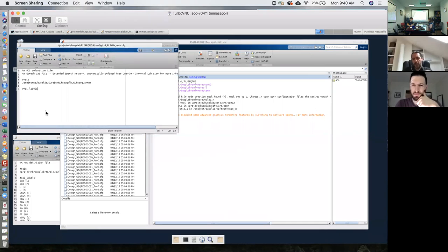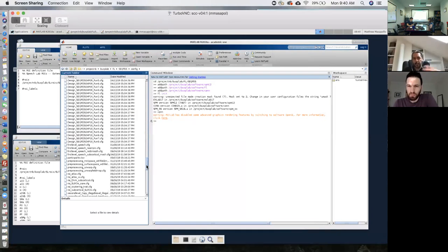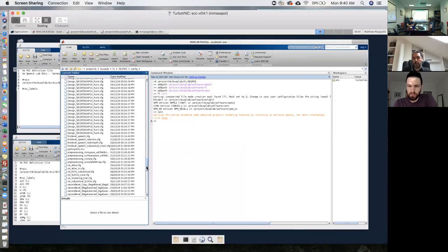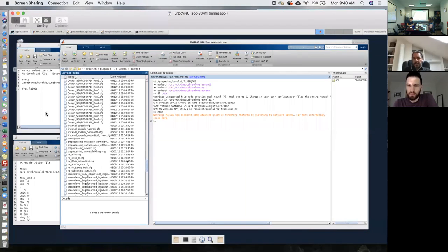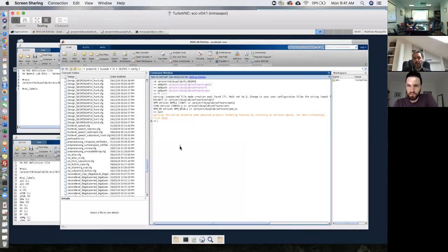I know Jason has converted these surface-based ROIs to an MNI template, projecting them so that people can use them if they have MNI-based data. Although that is a little bit suboptimal because the transformation between FS average and MNI coordinates is not all that robust across subjects. So I was just asking these questions to figure out which of all of these potential cases applies to doing analysis using our speech lab ROIs on your data.